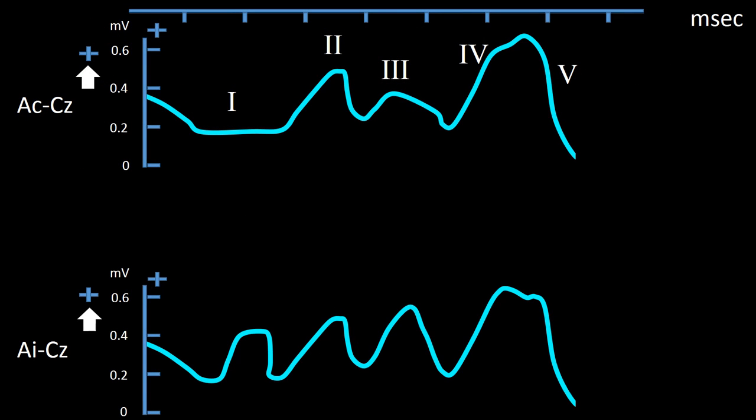Significant uncertainty exists as to the type of field producing the different waves that encompass the brainstem auditory evoked potential. Most papers I have read on the subject concur that wave 1 is brought about as a negative field restricted to the site of the stimulation, and perhaps a positive field diffusely affecting the whole head.